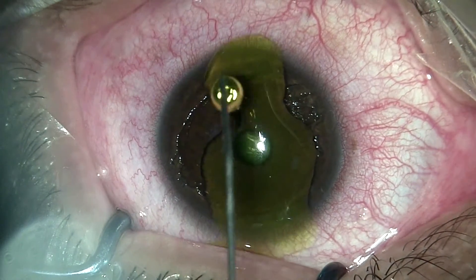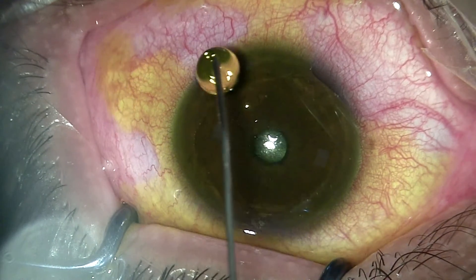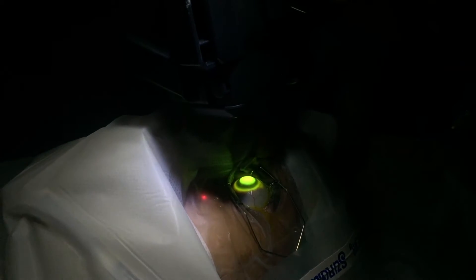This is the riboflavin dye, which we keep applying for the next 30 minutes so that it is well absorbed into the cornea. Once the 30-minute dye exposure is done, we proceed with the ultraviolet exposure. When it gets absorbed by the collagen fibers of the cornea, it makes the cornea more rigid and delays the progression of keratoconus.